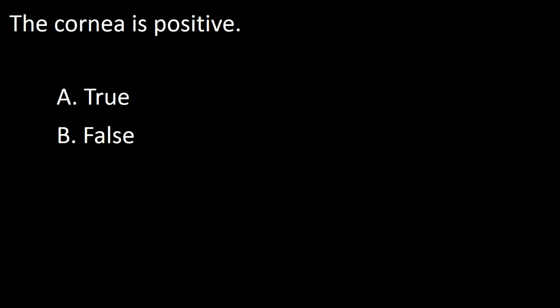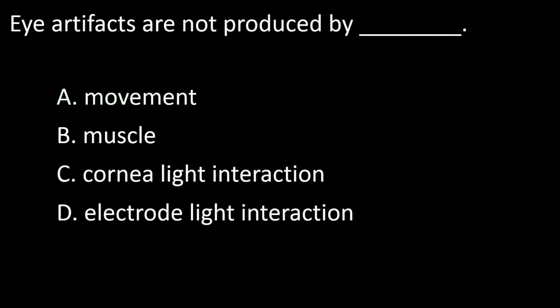So the answer to this question is true. Next question. Eye artifacts are not produced by A. Movement, B. Muscle, C. Corneal light interaction, D. Electrode light interaction.